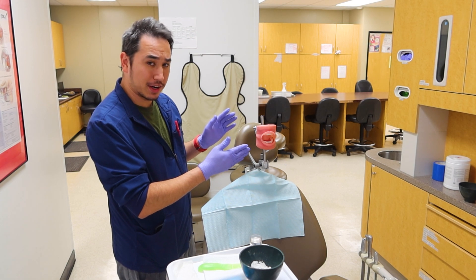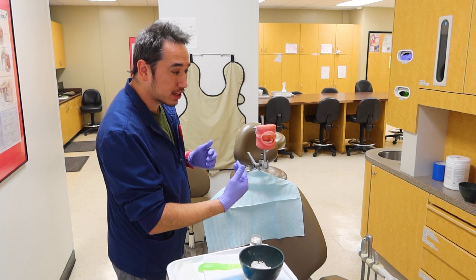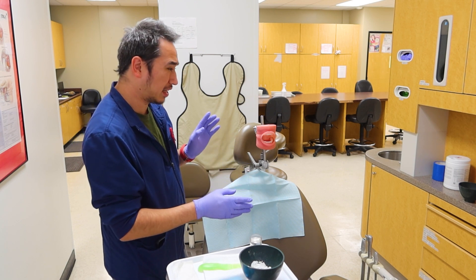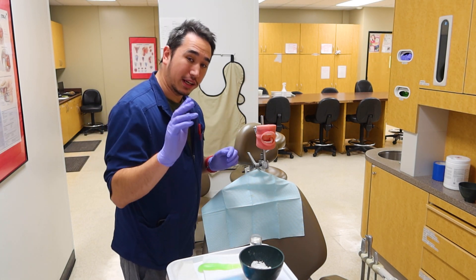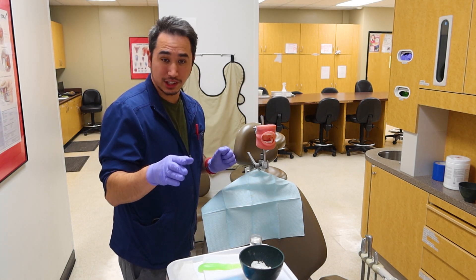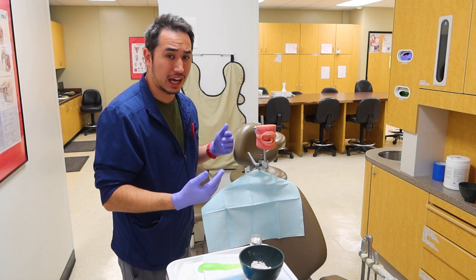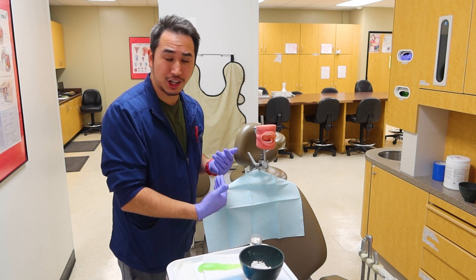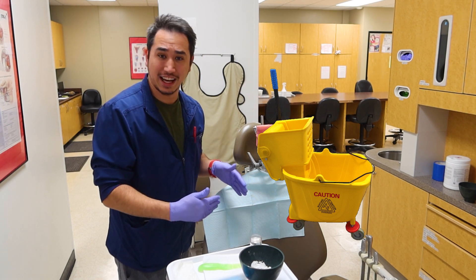Always pre-prepare your patient. Let them know: we're going to be taking this impression, you're not going to normally feel like you're breathing — I recommend you breathe through your nose. Try to keep it away from your mouth because you're going to be preoccupied and filled up at the moment. Always during this, remind them to wiggle their toes, shake their nose, think about something else to distract them, so that if they have a gag reflex it doesn't cause a chain reaction throughout the office.